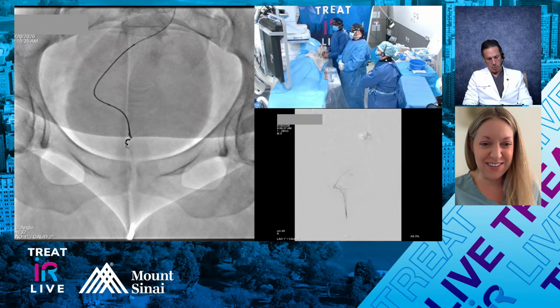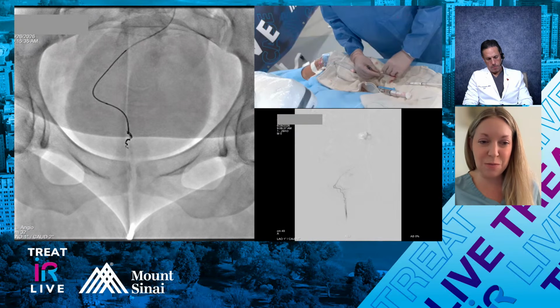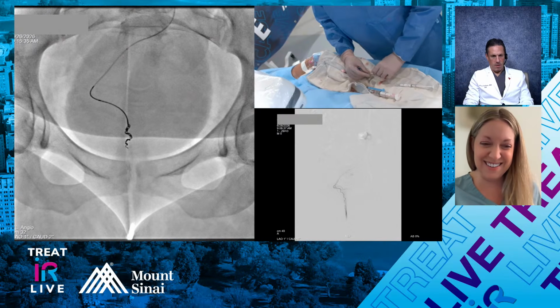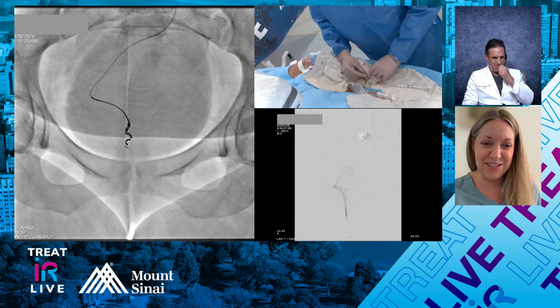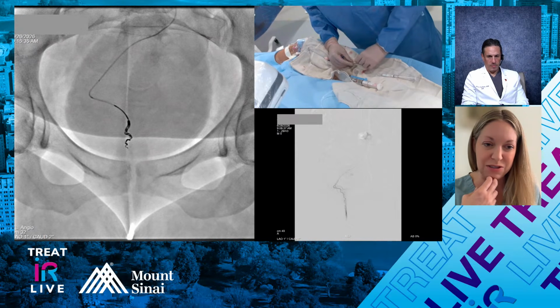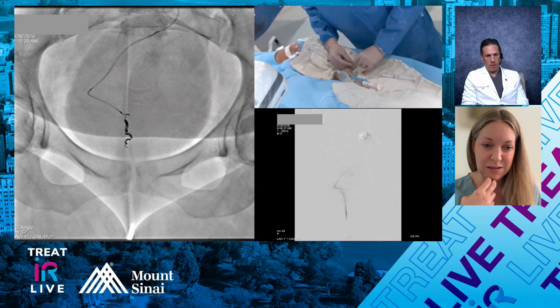Did you say the most expensive or the least expensive? The most expensive. That's beautiful. That's really nice. That's good. It's packing well. I was thinking it might take a 2 also, Aaron, but this is packing very well with the softs. That's great. This little turn here, this is a tremendous coil. I love the soft coil.